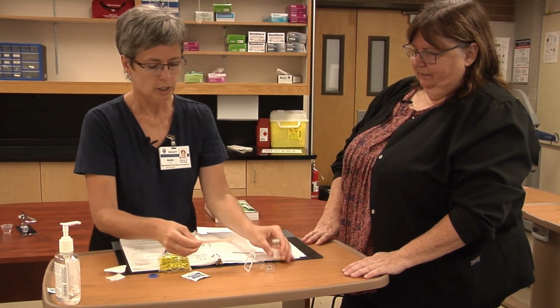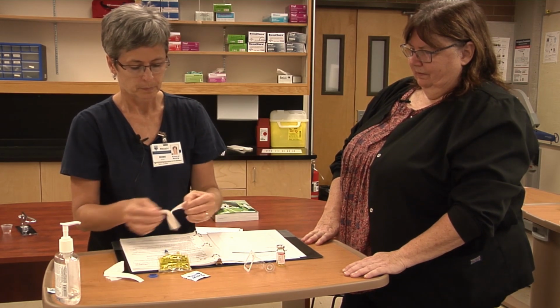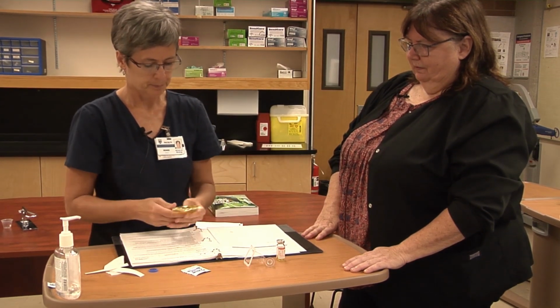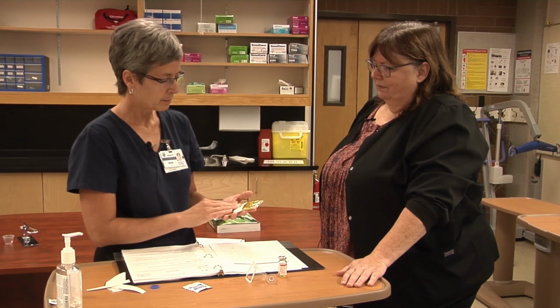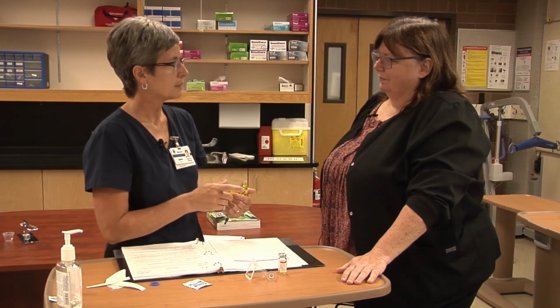Just do another quick check, and then we're going to put our IV label onto our mini bag. Sometimes when I was learning about IVs, I would make little notes on my IV label to infuse over 30 minutes or infuse over 20 minutes, just as a time-saving step, so I didn't have to keep running back to the monograph. So that might be something that students think about. Okay, so I'm confident that I am going to give this medication over 20 minutes. Now we'll go to the bedside.